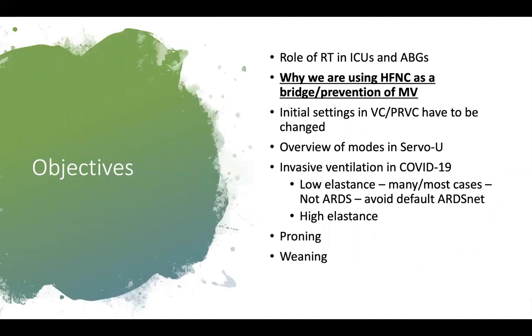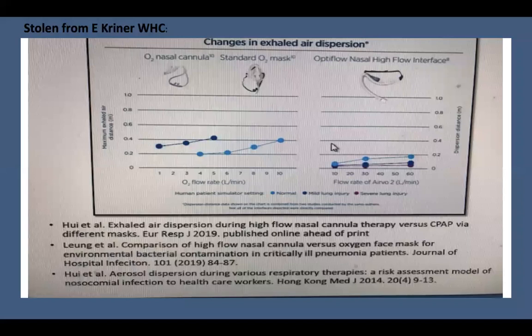Another thing that is different is our use of high-flow nasal cannula during this pandemic. We are using it to avoid intubation. This is a device that over the last 5 years has grown in its ability and documented efficacy in minimizing intubation, mitigating respiratory failure, and even post-extubation respiratory failure.